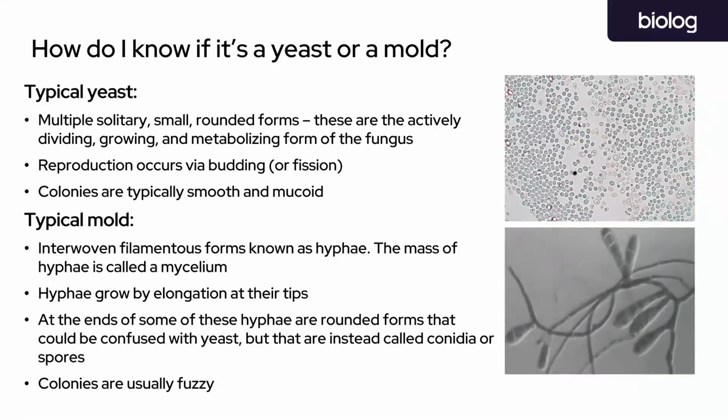Now for the other part of the question, can you run yeast on an FF plate? Short answer is yes, you can. But in general, most of the entries that are yeast are only available in the yeast database, so your ID results probably won't be there. That is with the exception of several dimorphic fungi. There are those out there, such as some Candida species, for instance, or Cryptococcus as well, that have a yeast phase on some culture media and have a fuzzy or hyphal phase on another type of culture media.